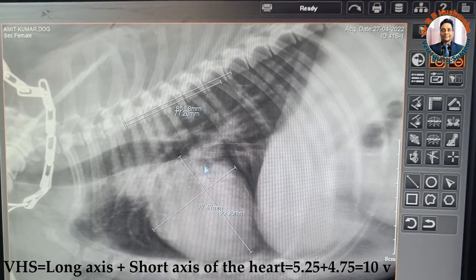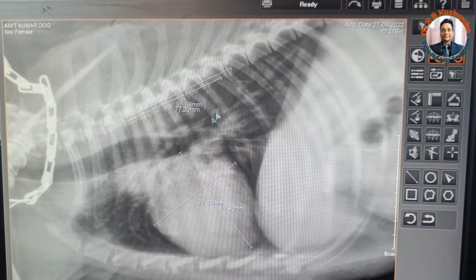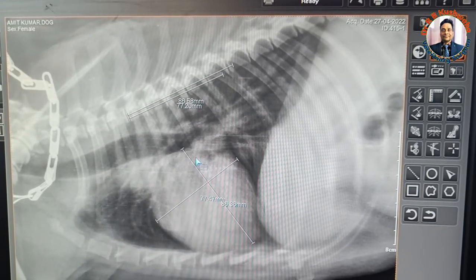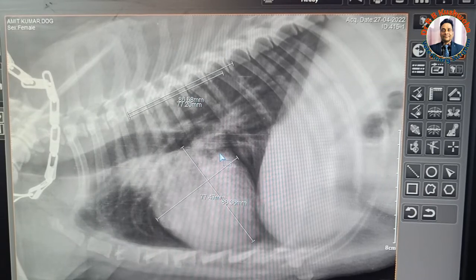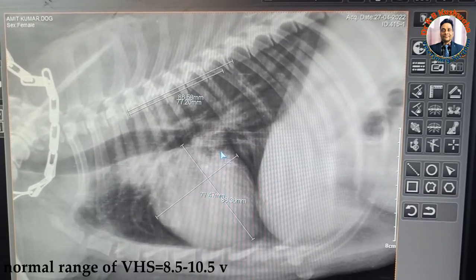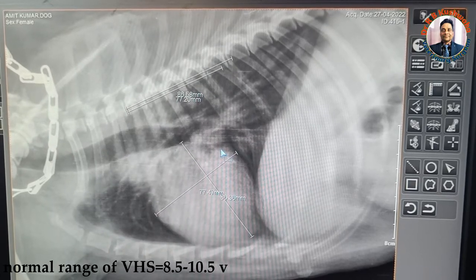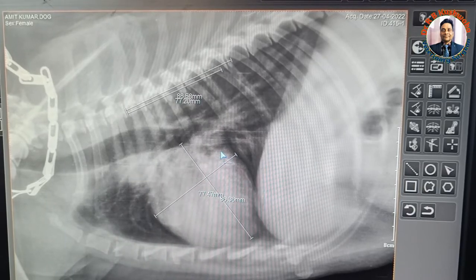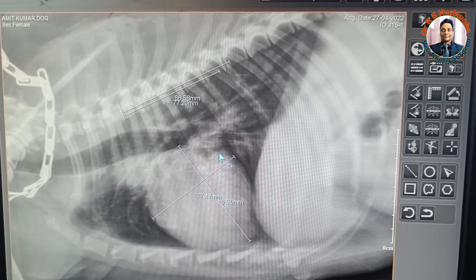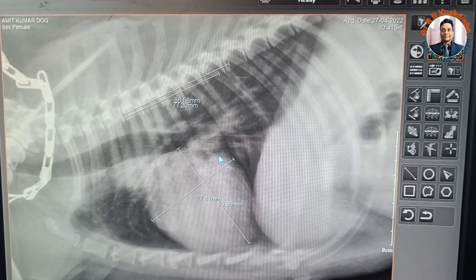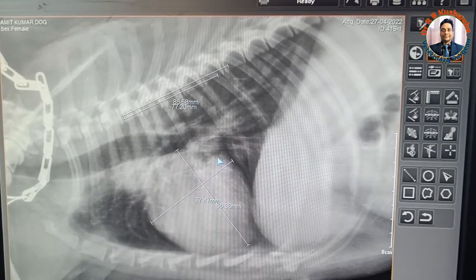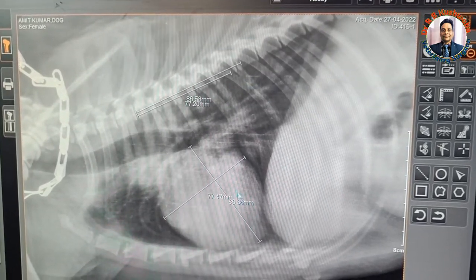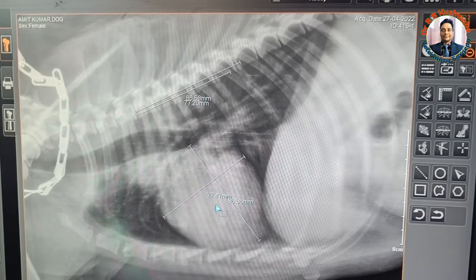For this vertebral heart score of 10 V, the cardiac size is normal because this is a small breed — a Spitz dog. For small-sized dogs, the average VHS is from 8.5 to 10.5 V. However, in large breeds such as German Shepherd, Golden Retriever, Labrador Retriever, and Boxer, a VHS up to 11 or 11.5 can still be normal. So per the vertebral heart score, this result is absolutely normal.